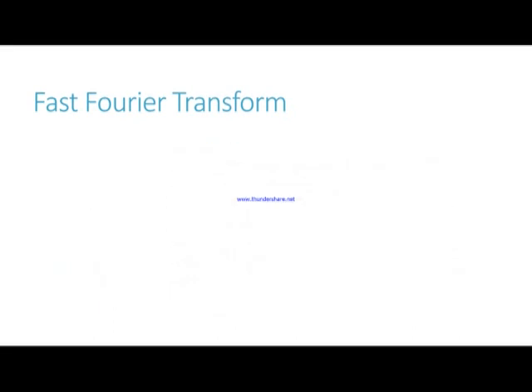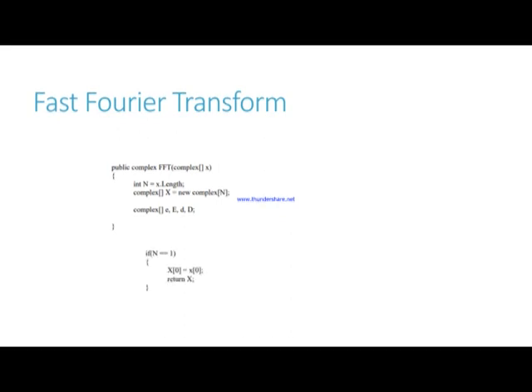As a basic implementation, I'm going to describe this with a basic function that takes the FFT of the input signal using C#. To begin, a function must be defined because this function will be used in a recursive fashion when rearranging the time domain samples. A check must be put in place to verify the size of the array being passed is greater than 1. If it is equal to 1, only that value should be returned.